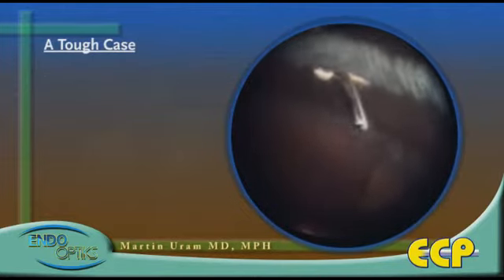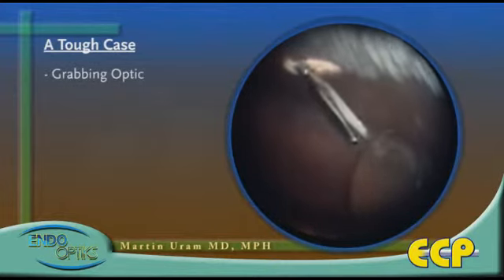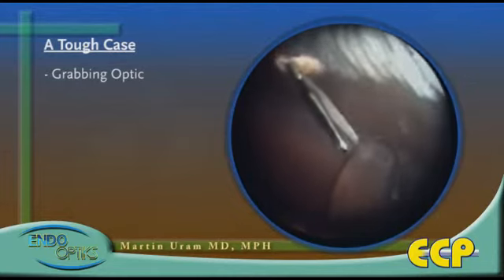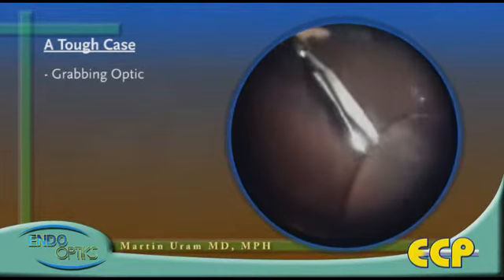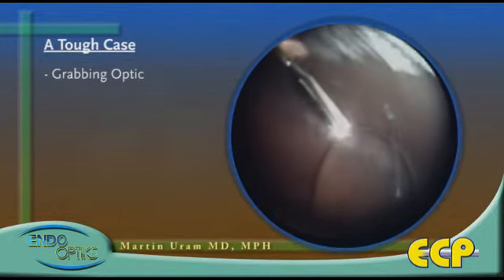This is difficult. An intraocular forceps is used to grab the edge of the optic. It's usually easier to grab the haptic, but there aren't any here.